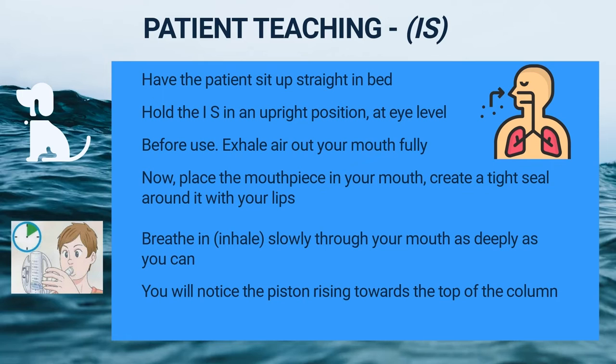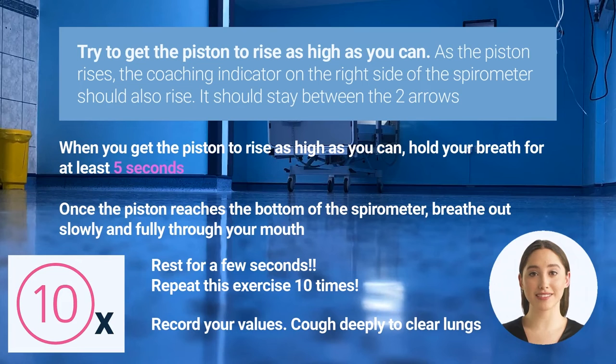Place the mouthpiece in your mouth and create a tight seal with your lips around it. Breathe in as slowly and deeply as possible. You'll notice the piston rising toward the top of the column — the deeper you breathe in, the higher the piston will rise. Try to get the piston to rise as high as you can. As the piston rises, the coaching indicator on the right side of the spirometer should also rise and stay between the two arrows.